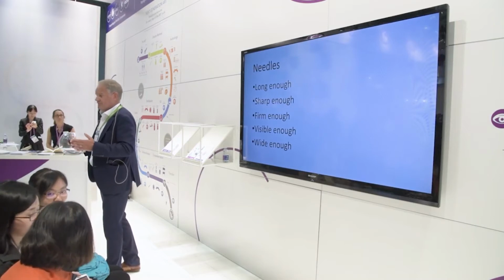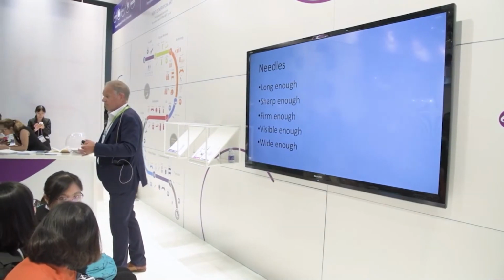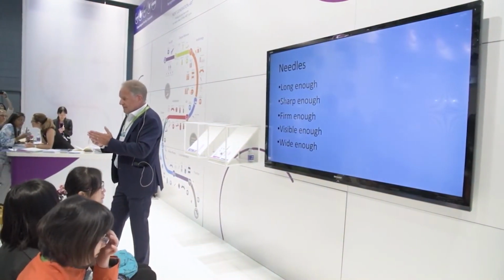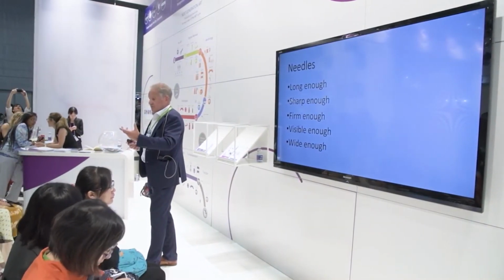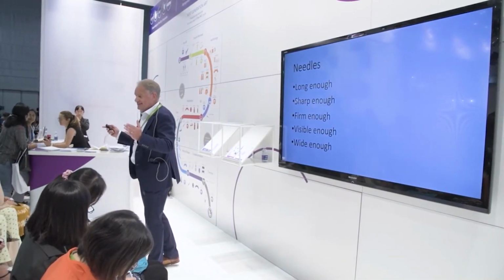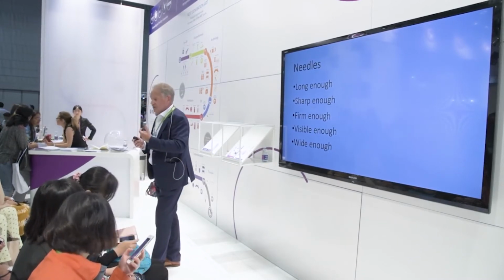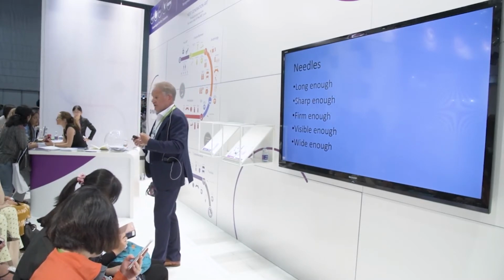And my supervisor for my MD, Professor Robert Edwards, always told me that the oocyte cumulus complex could be 1 millimetre in diameter. So really you had to aspire to getting a needle that had an internal diameter of 1 millimetre. And as you know, if you talk about laminar flow down a river, the flow is more turbulent near the banks. It's more laminar near the middle. So what you don't want is a turbulent flow that might damage the oocyte as you aspirate it out of the needle, out of the ovary.